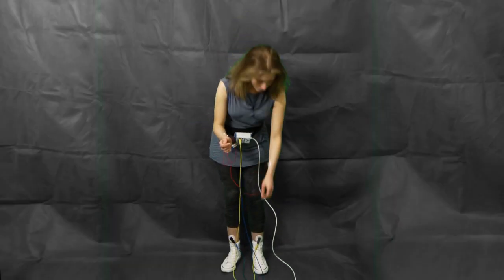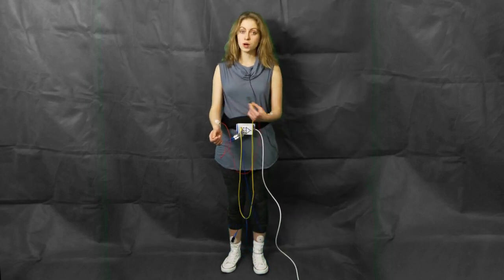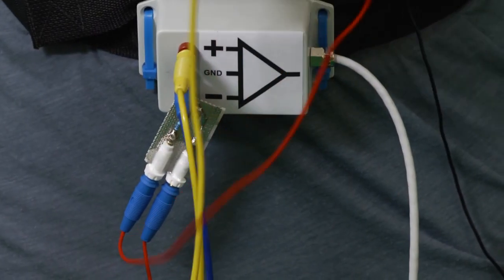Apart from aVF, we can also use the positive electrode and connect this one to our two arms and in turn get our additional two leads, aVR and aVL. So let's take a close look at each lead one by one.